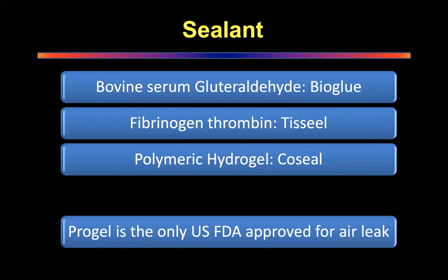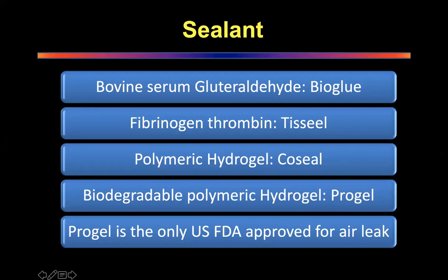It works very well in pediatric surgeries where you're going to do multiple surgeries in future, so you don't want the heart to stick to the back of the sternum. Similarly, in adult cardiac surgery you can use CoSeal, particularly when you're doing aortic surgery or an elephant trunk in two stages. You don't want adhesion, so CoSeal is used. But CoSeal is also used as a lung sealant, and there are some studies which have looked at it, and it's a decent enough product.